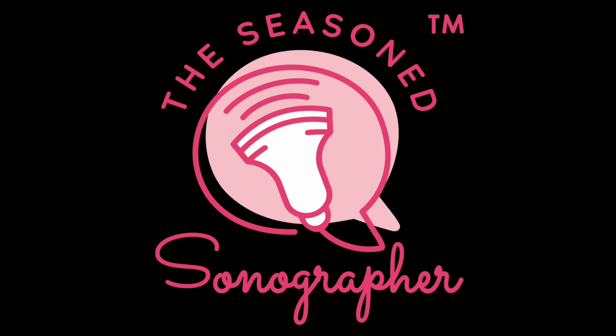Some of the challenges in first trimester ultrasound include maternal body habitus. Again, it can be hard. You have to adjust that depth. You have to use a little more pressure. Definitely use the transvaginal approach because your transabdominal is going to be very limited.